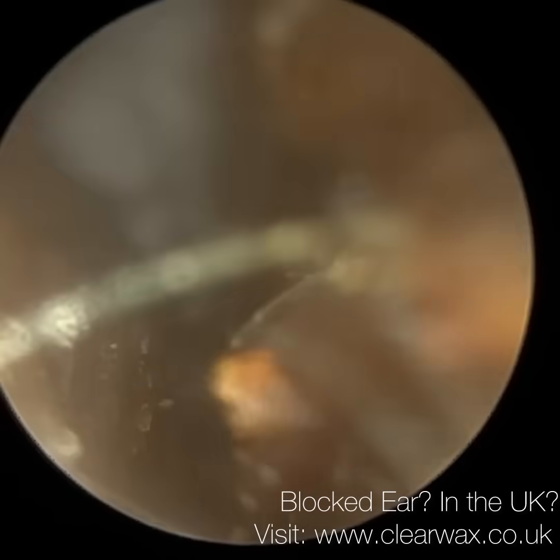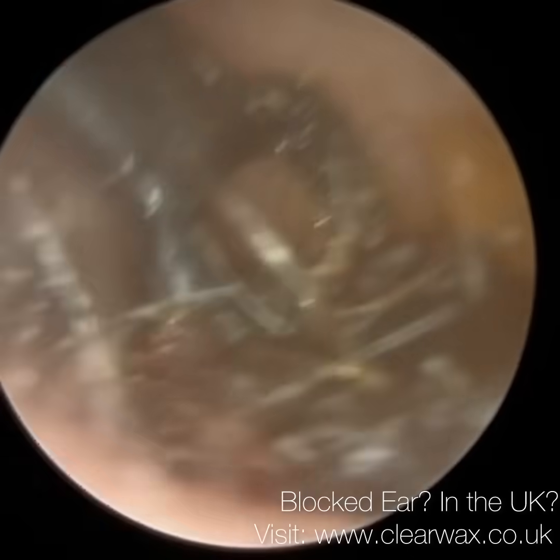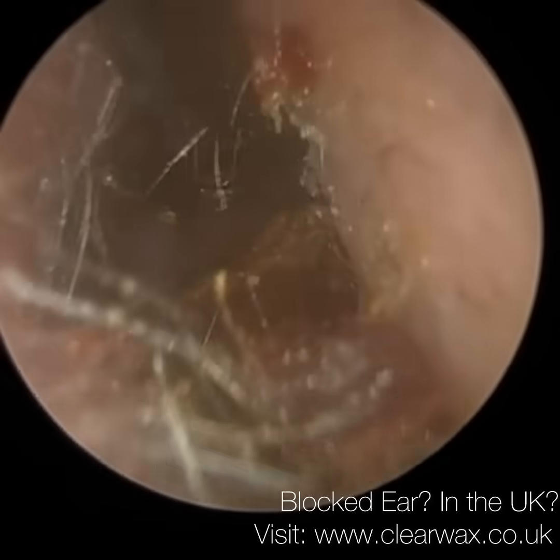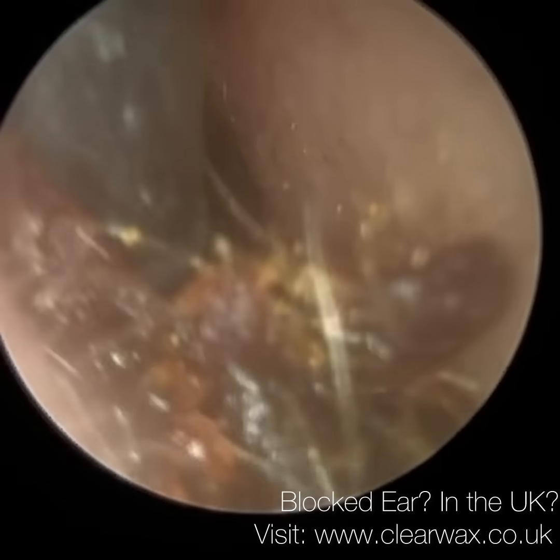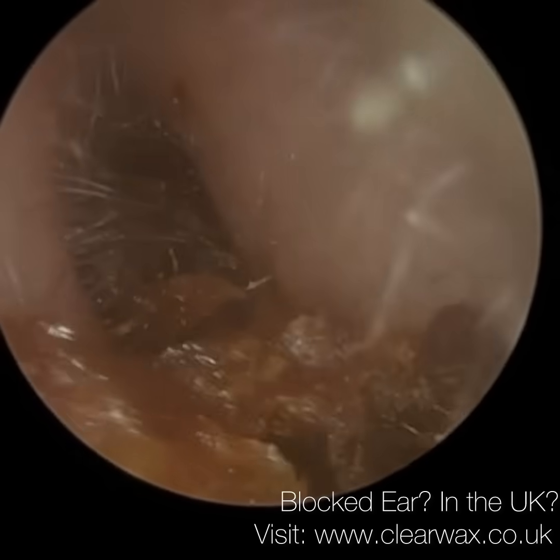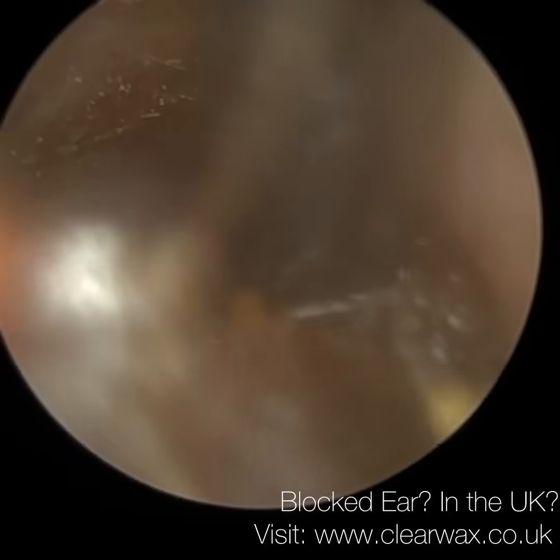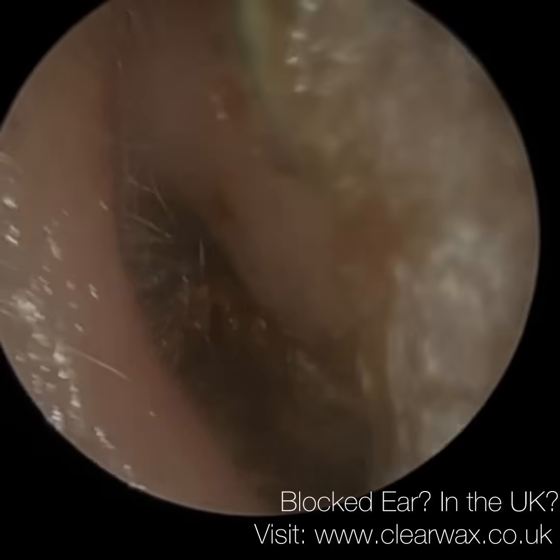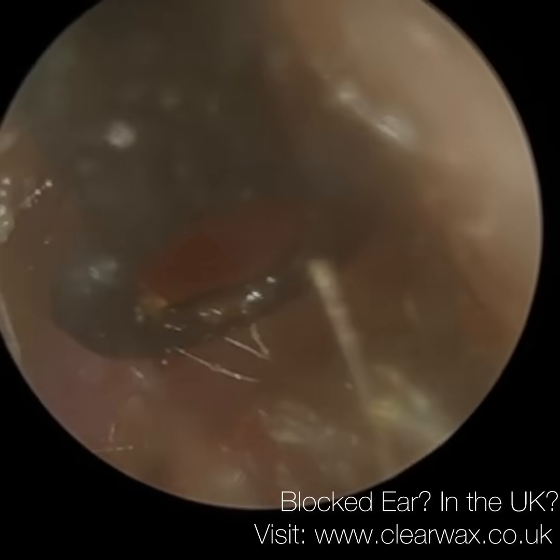Here's the Curette. Initially, I just want to remove this outer blob of wax, if you want to call it that. And as I'm bringing it through, it's getting trapped, because the endoscope is no longer dilating open the ear, it's getting trapped at this narrow part. Where this wax is formed in the inner two thirds of the ear canal, I would say the ear canal diameter is probably 3 or 4 times wider, maybe even 5, than the entrance of the ear. So the wax that has accumulated there is into a plug. When we're bringing it through the entrance, naturally there's going to be a bit of resistance because the entrance of the ear is narrow, especially when I'm having to remove the endoscope to bring the wax out. Otherwise the wax will just hit the endoscope.